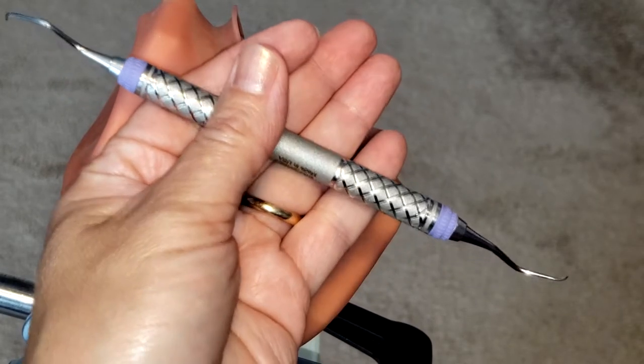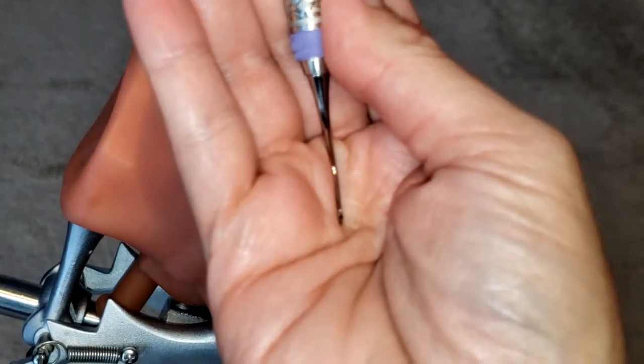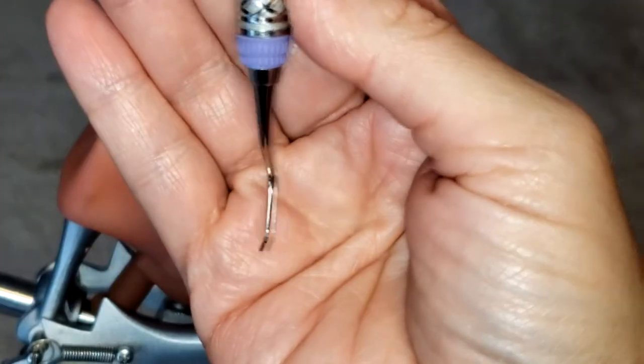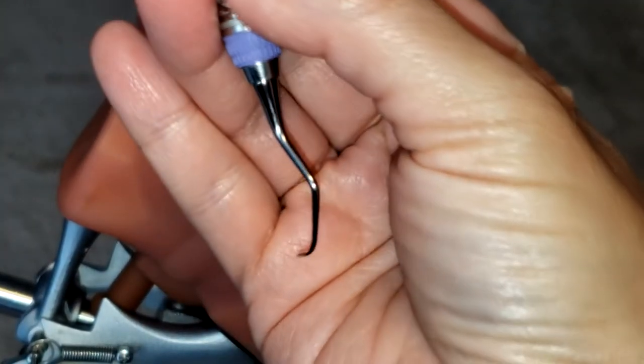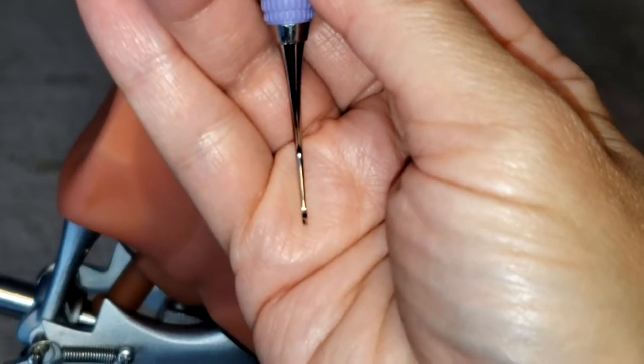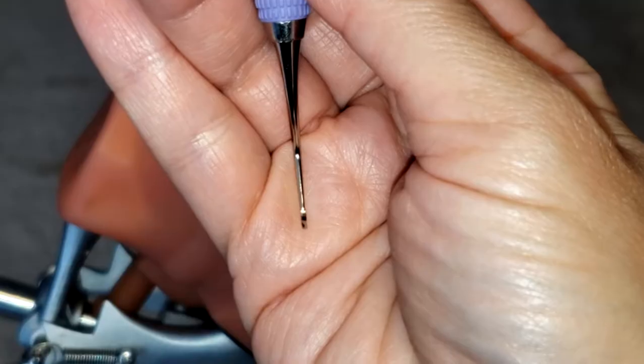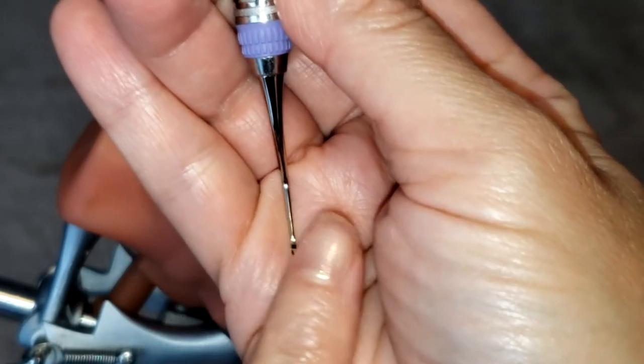Now, because this instrument is a curette, if you take a closer look, you can see that it has a rounded toe and a rounded back as well.